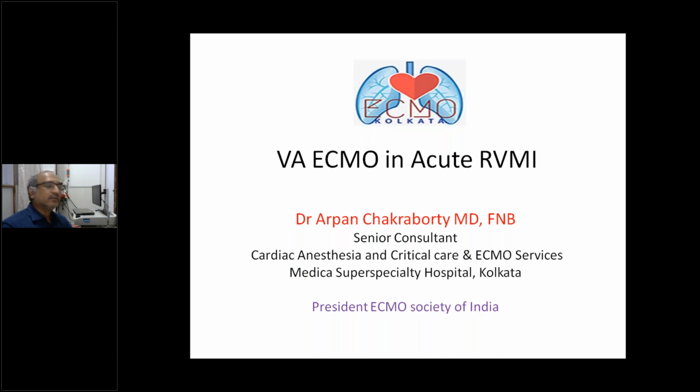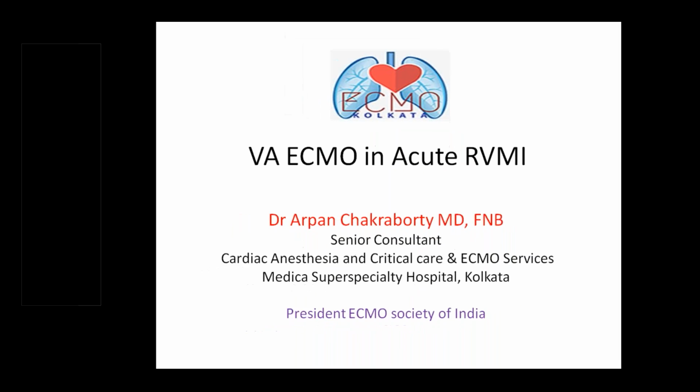Where the heart is not reacting, the use of IABP is not very useful. Secondly, if the patient's rhythm is abnormal, with fast or recurrent VT going on, the IABP is not augmenting cardiac output. In those patients, we have to go for any other mechanical support.